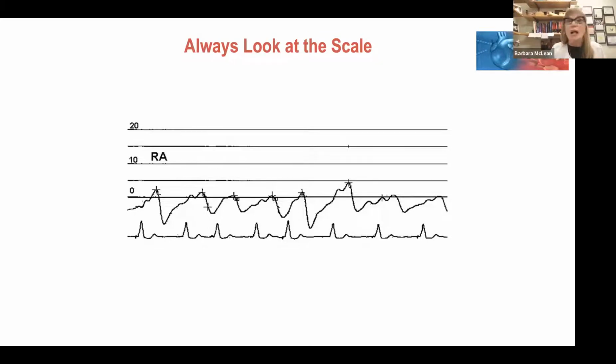We have very developed central venous catheters with one-way valves that you can only open if the fluid pressure, 300 millimeters of mercury through the transducer, keeps that one-way valve open. And so it is very important for me to appreciate the way I get gas into my lung as I'm breathing spontaneously. When the diaphragm descends, the pressure in the thoracic cage goes down, and it goes down less than atmosphere, and that sucks the air in. That's how I breathe. That drop in thoracic pressure is also communicated to your right ventricle.